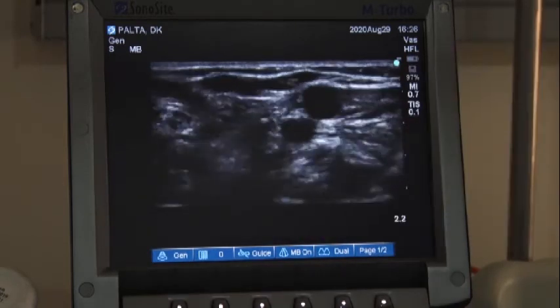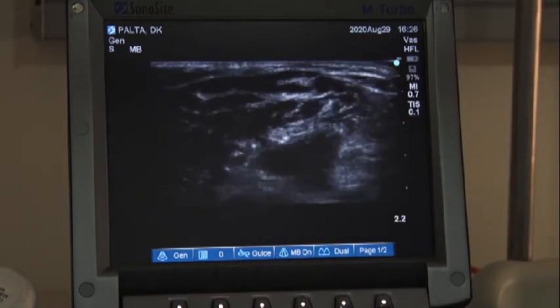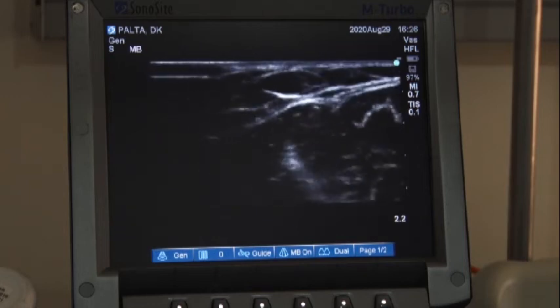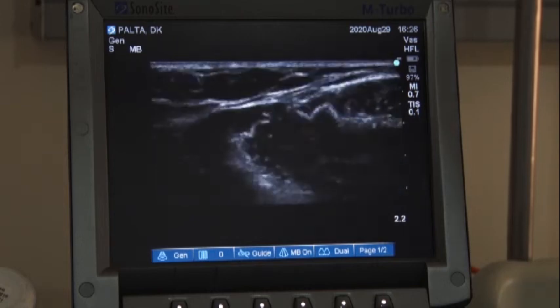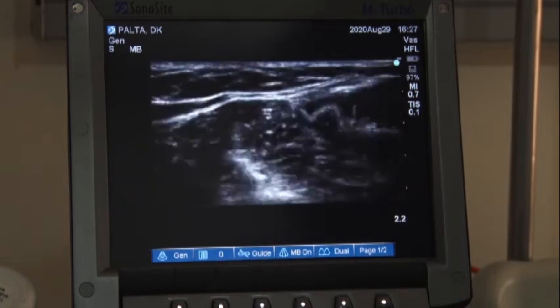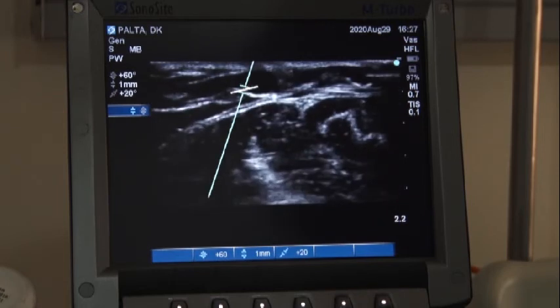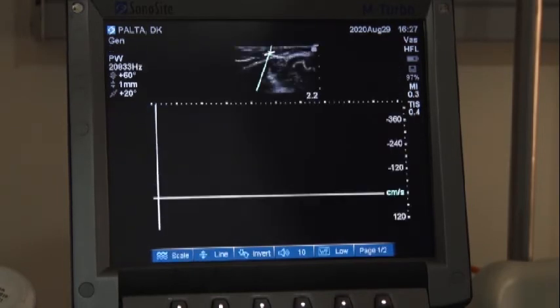This is again dividing, and this is going to form the cephalic vein of the arm, and we'll see now how much flow is in the cephalic vein. So we have to find out the outflow vein. So we'll see now the outflow vein.